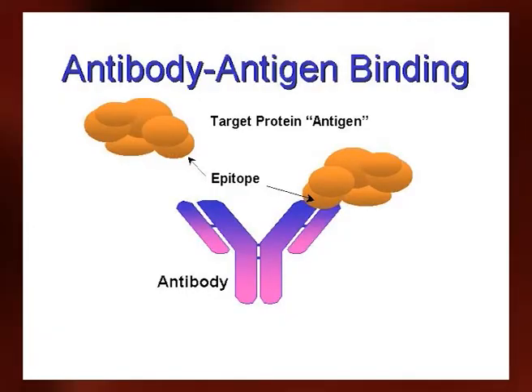In a positive reaction, a line of precipitate will form between each antigen well and the antibody well. This assay can also determine the similarity of the antigens. During the diffusion process, different antigen-antibody complexes migrate at different rates. Consequently, a separate line of precipitate will appear in the gel for each antigen-antibody complex.